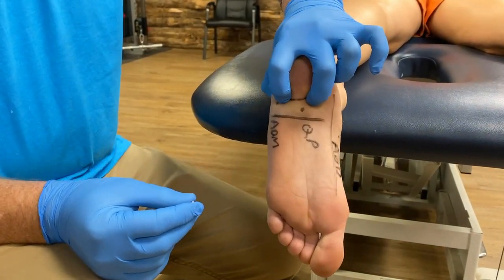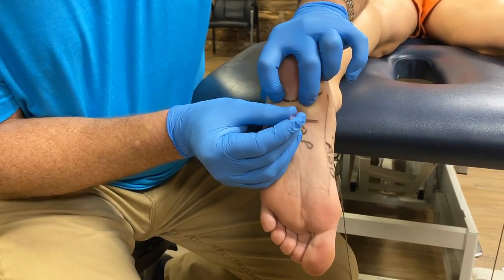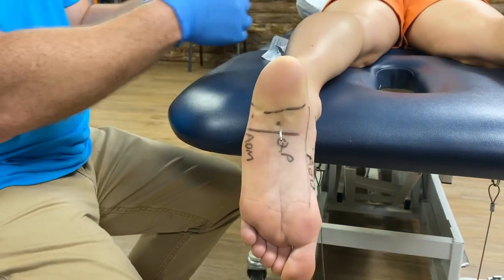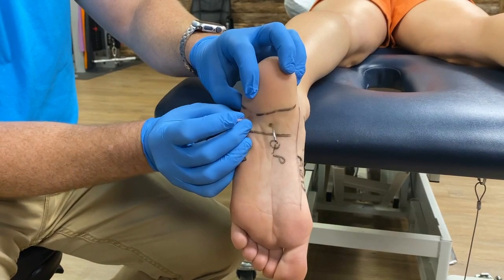It's really important to apply hard distracting pressure at the calcaneal tubercles — that'll really help with the insertion. You want to mash your guide tube into the skin very well. Give it a good hard tap and then send it all the way into her calcaneus. You don't want to go too slow here because it will be uncomfortable, so you want to maintain a good, decent pace.